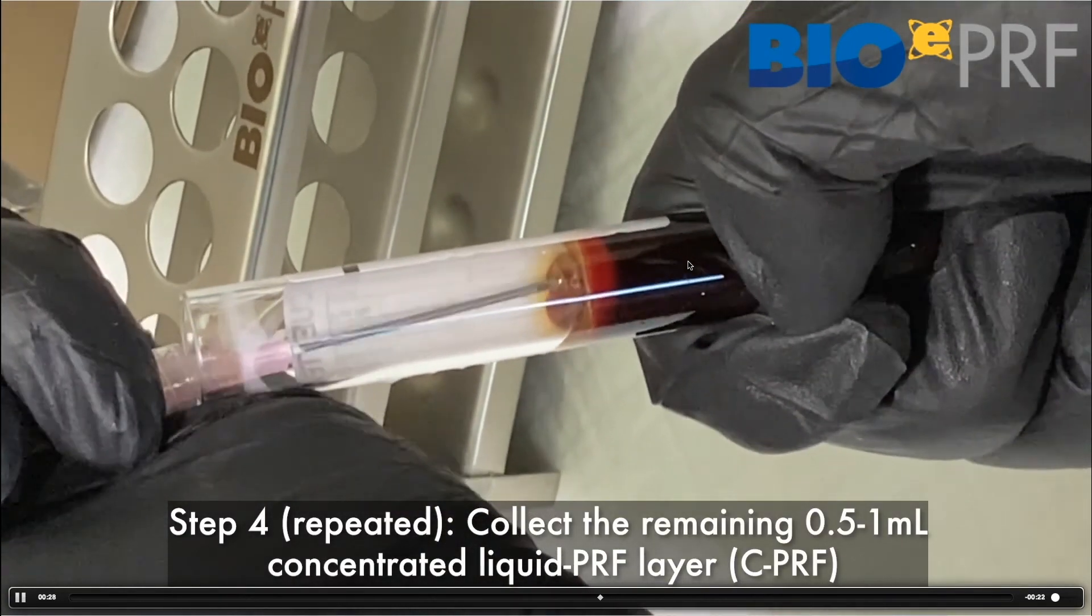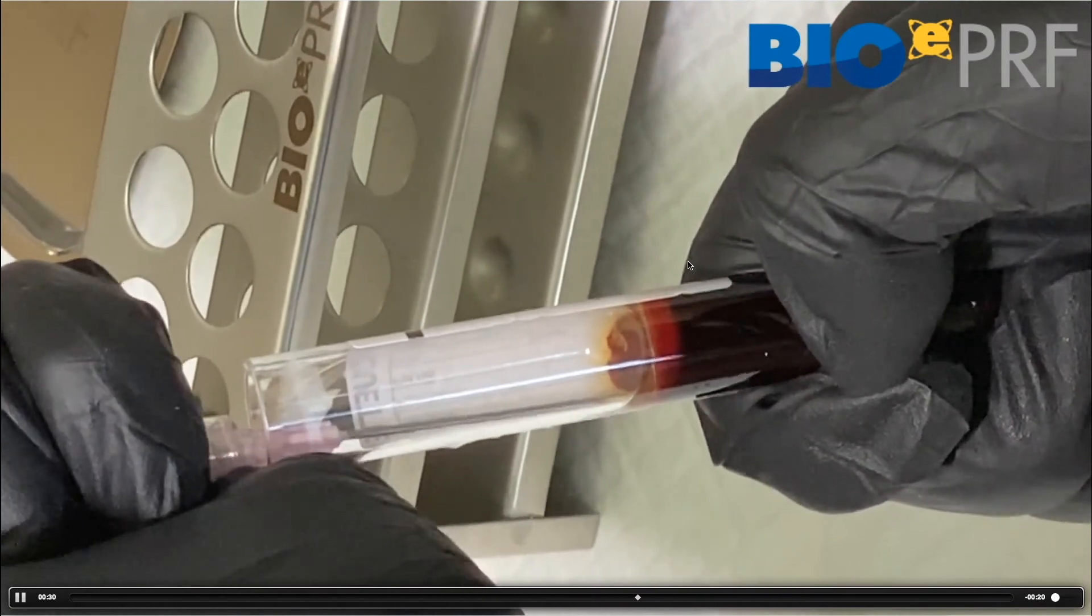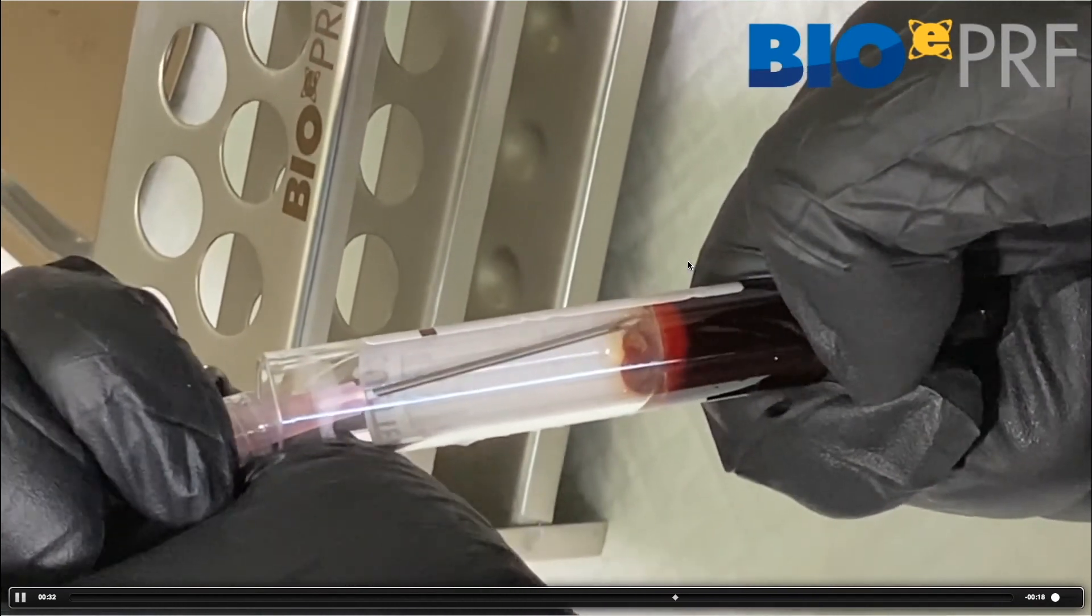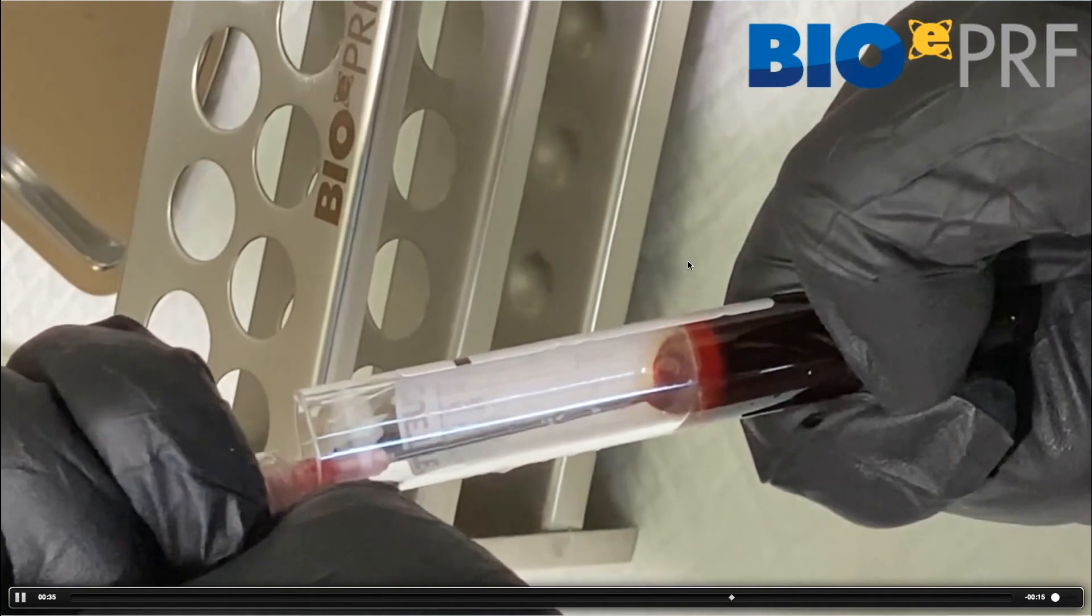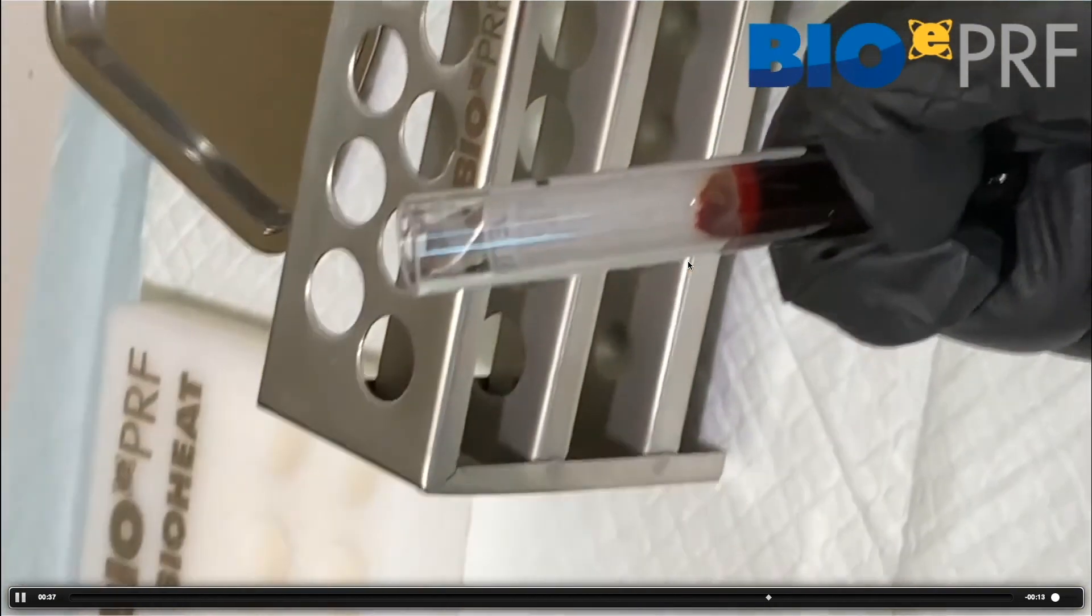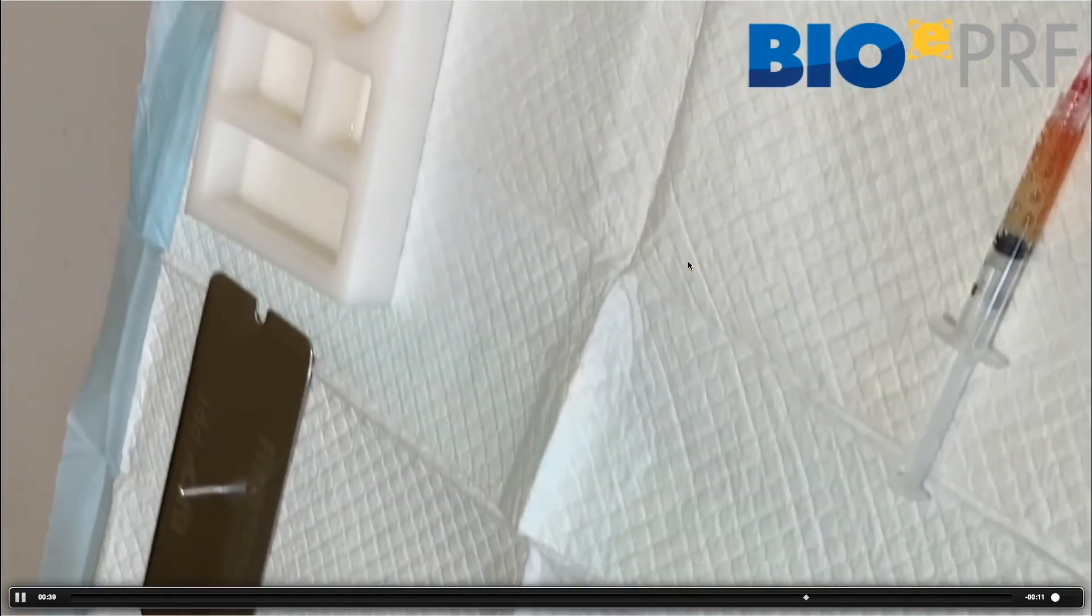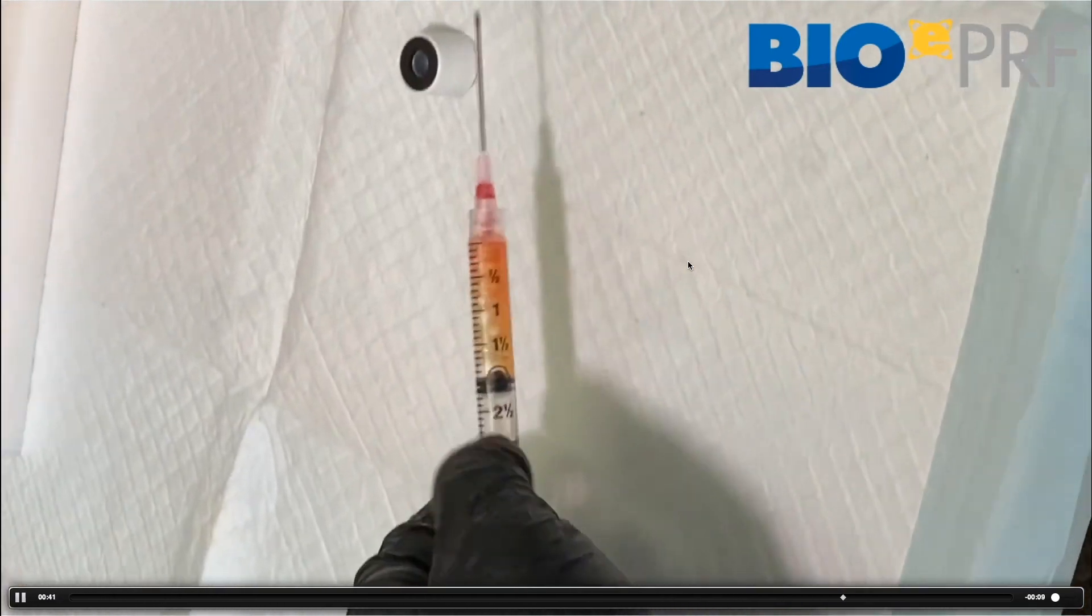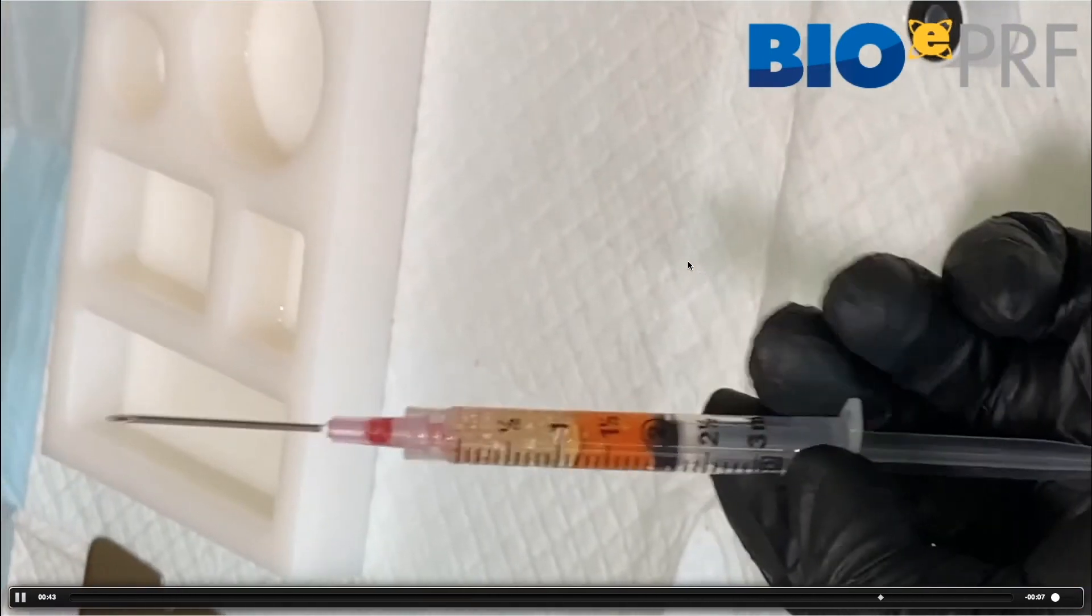Like I said, about 15 to 16 times the platelet count from baseline, whereas typical I-PRF is usually two to three fold. So there's a big difference here. And like I said, we'll take a little bit of the red blood cells as we reviewed in chapter three.